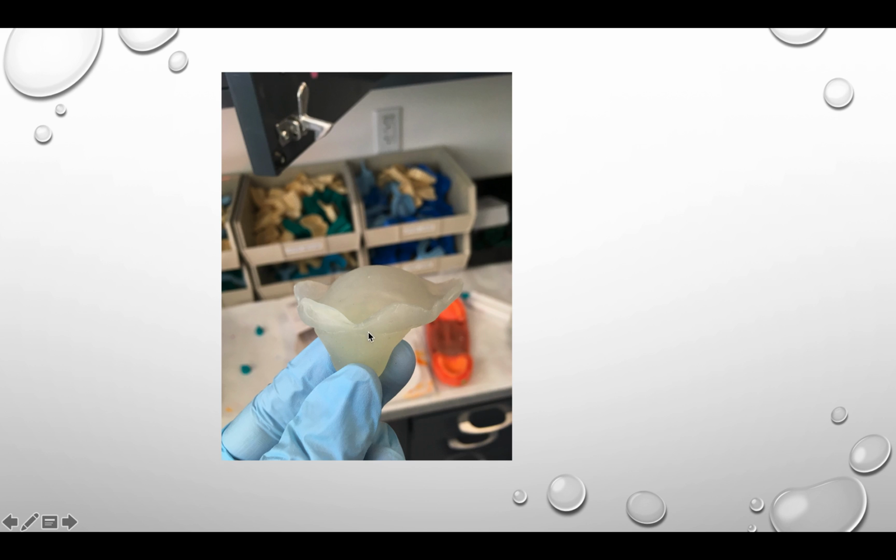As you can see, this custom tray has a handle on it, but it is not required to have that. You can either add that or not have it. Either way, it doesn't really matter.